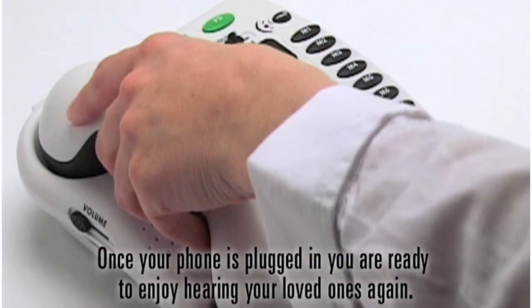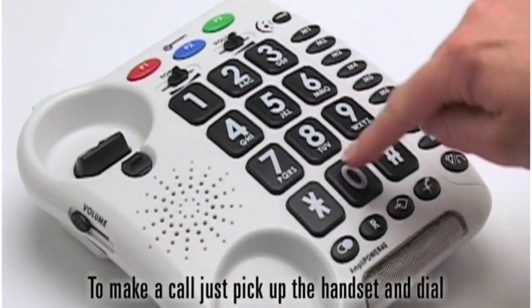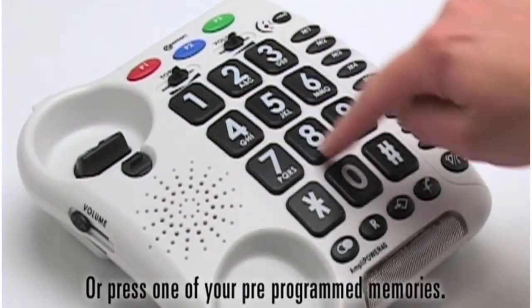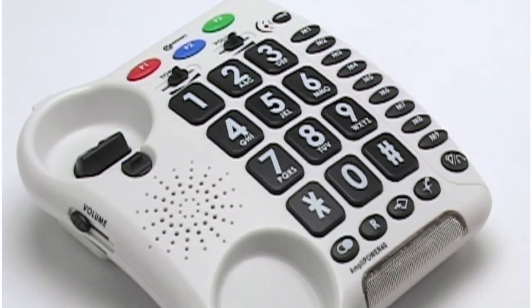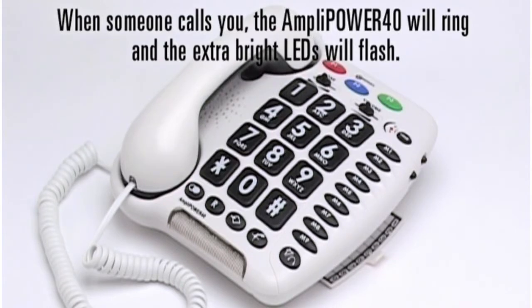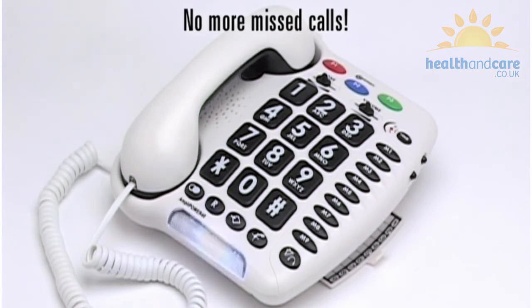Once your phone is plugged in you are ready to enjoy hearing your loved ones again. To make a call just pick up the handset and dial, or press one of your pre-programmed memories. When someone calls you, the AmpliPower 40 will ring and the extra bright LEDs will flash. No more missed calls.